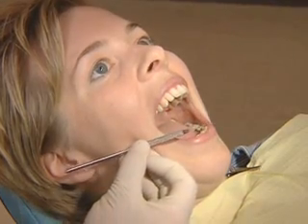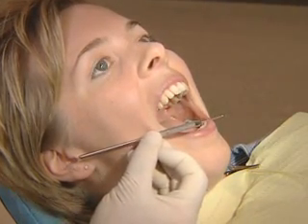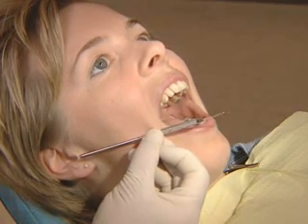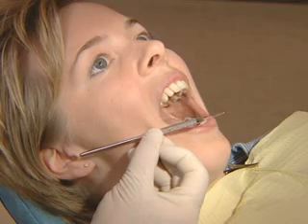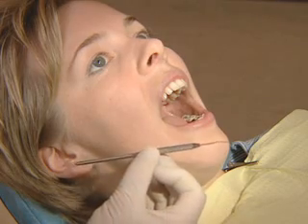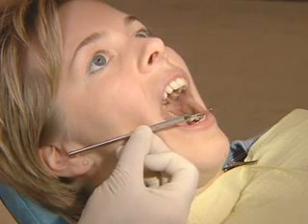The patient should open her mouth wide, and you're lining up the plane from the corner of the mouth to the intertragic notch, which is that part of the ear just below the tragus. And this gives the correct angle that the syringe will take when you're going intraorally. It is also helpful to look at the angle that the tragus makes with the face, as that also will help with the orientation of the syringe intraorally.